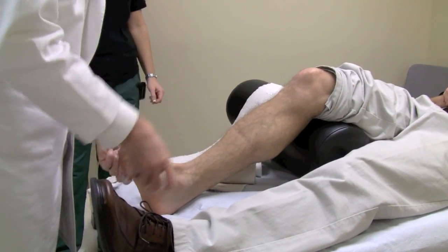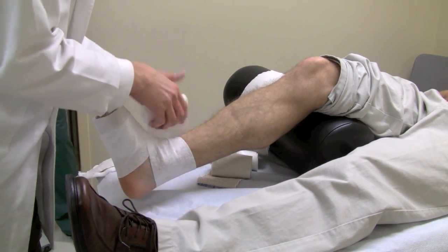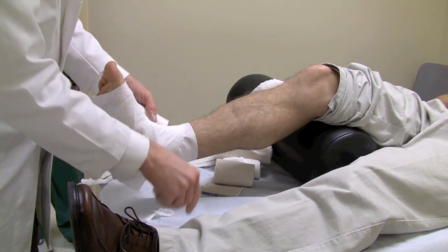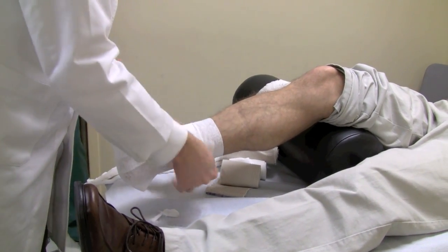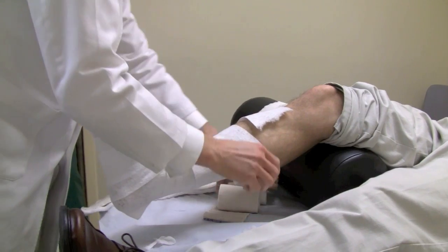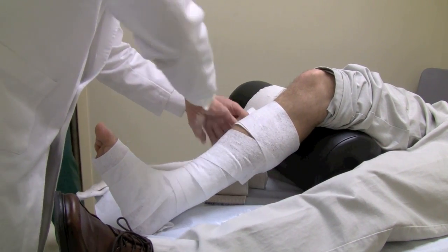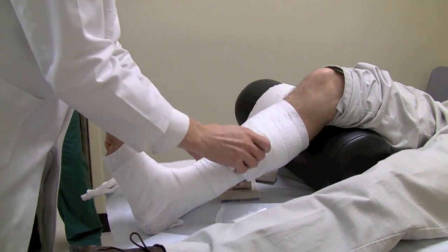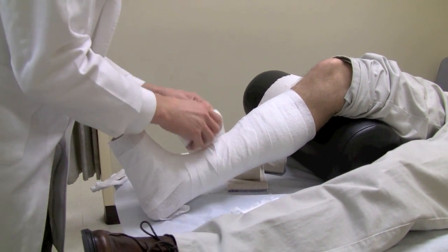When you've got an acute injury, it's pretty difficult to dorsiflex the ankle much past zero. You're putting on extra padding for comfort. You want to try to minimize the amount of wrinkles in the cotton — it tends to fit more comfortably the smoother it is. The cotton is easy to tear, so you can usually get a pretty smooth-fitting splint.